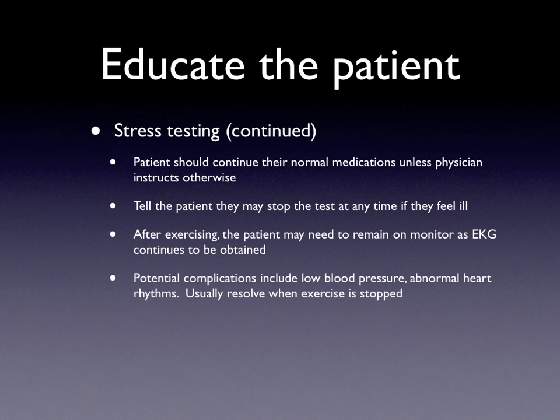Tell the patient that they may stop the test at any time if they begin to feel ill. It's up to them to look at you and say, I can't go any further, I don't feel well. After exercising, the patient may need to remain on the monitor as the EKG continues to be obtained. Sometimes they not only want to see what happens to the heart while it's exercising, they want to see how well it recovers from the exercise period.